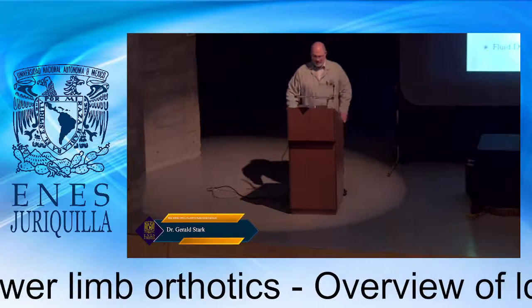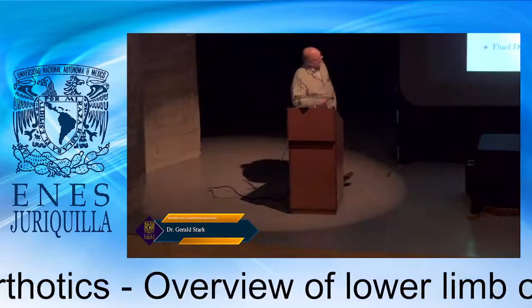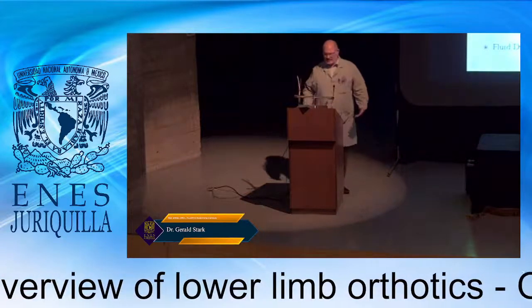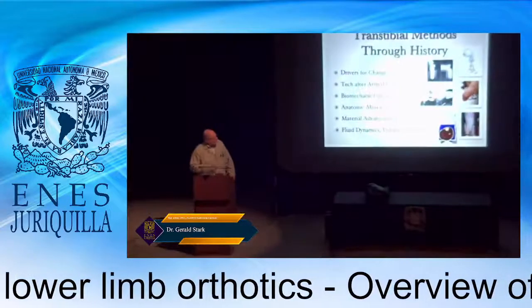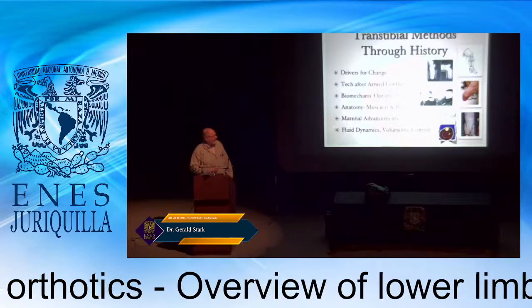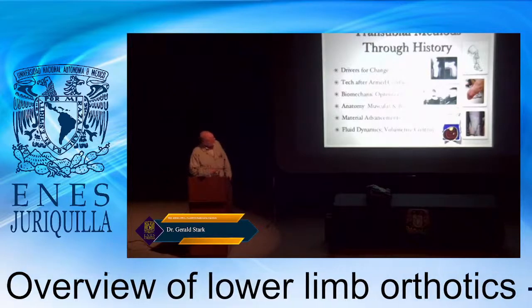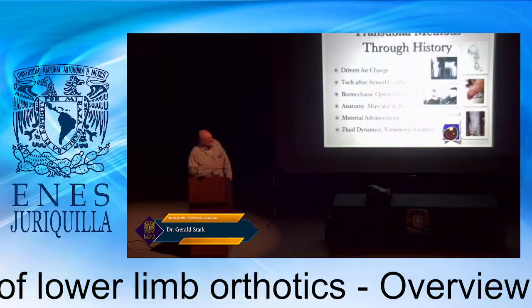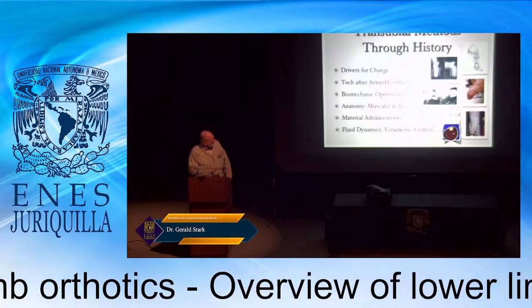But let's talk about transtibial methods through the history, and we'll look at different drivers of change, but also consistent issues that we've seen with transtibial methods. We're also going to talk about the anatomy and some of the changes in materials, as well as scanning and fluid dynamics. So when we talk about transtibial fitting, this is from a Dutch engraving from 1640 with joint and corset, a leather outer, and a wooden foot.